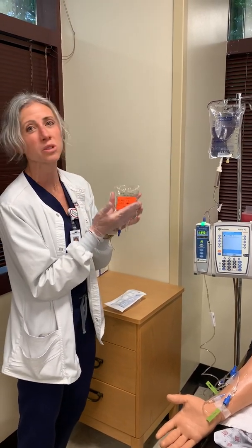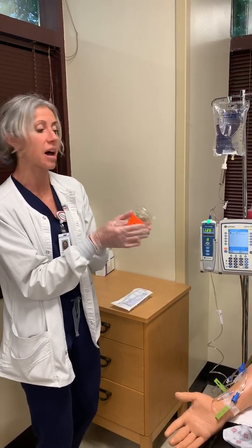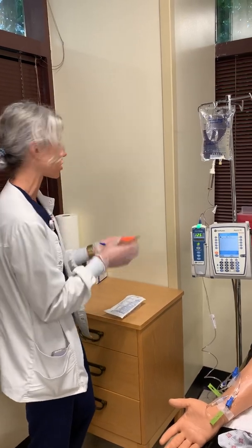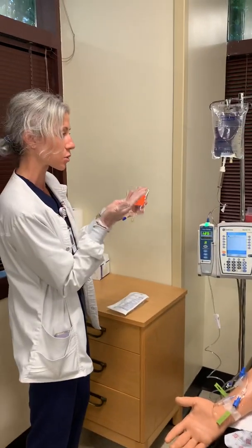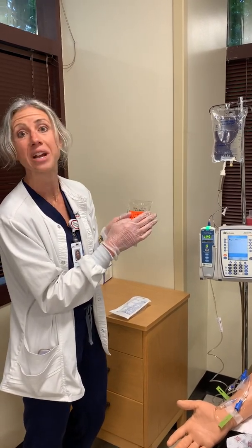You're gonna see in the hospital, it's very different. Some people have the bags in the Pyxis like this. Some of you are gonna get to learn how to dilute your own antibiotics and how we hang that, okay? So we wanna make sure that we've got the 100 ml bag. That's what the order said. I told Mr. Jimmy he was going to be getting this over an hour.